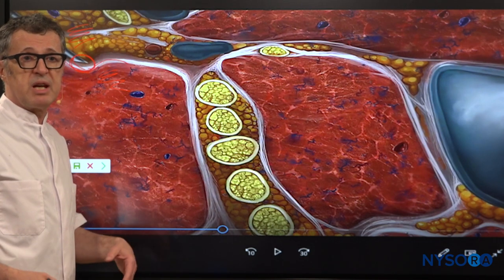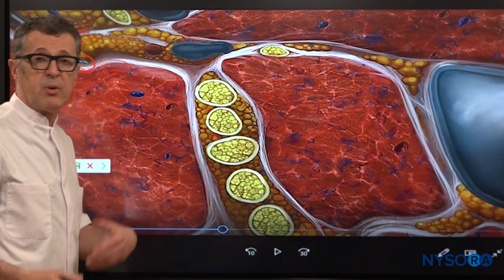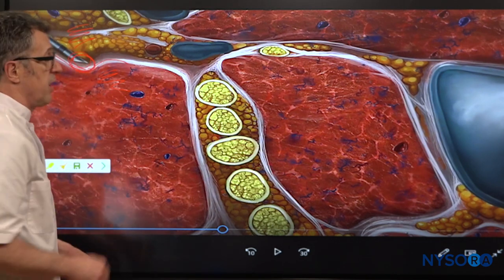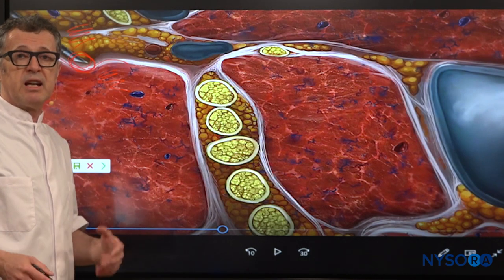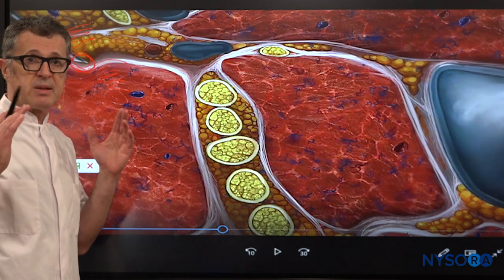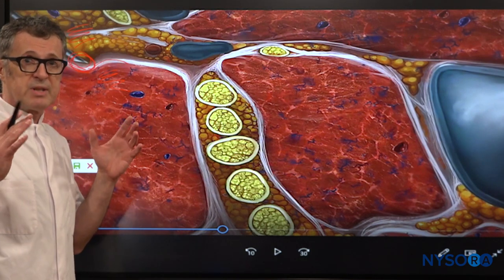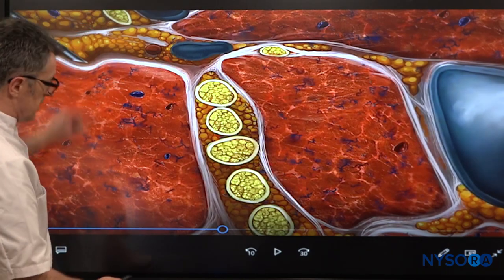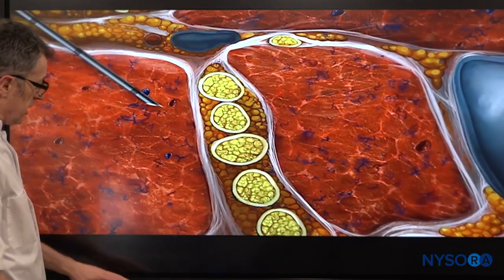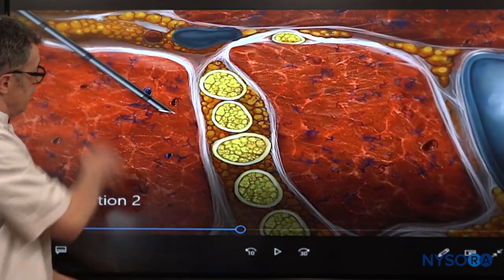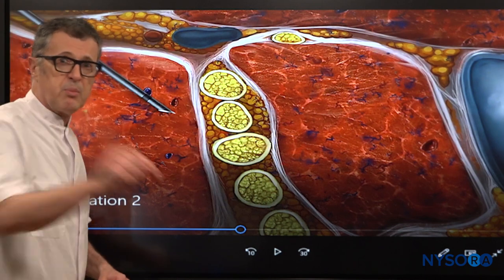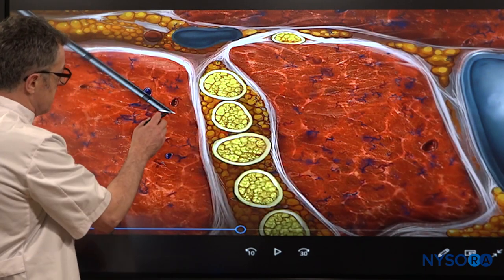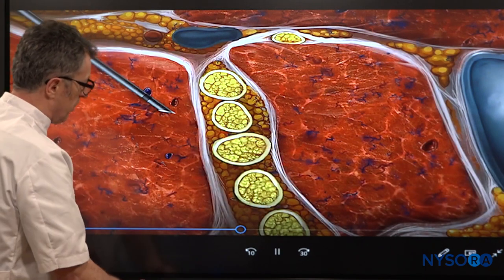Number one, you oftentimes perceive a pop or a click because you penetrate that tough layer. Number two, the needle tends to pass somewhat uncontrollably. As this cervical fascia gives in, you can see how the needle tends to penetrate without control.